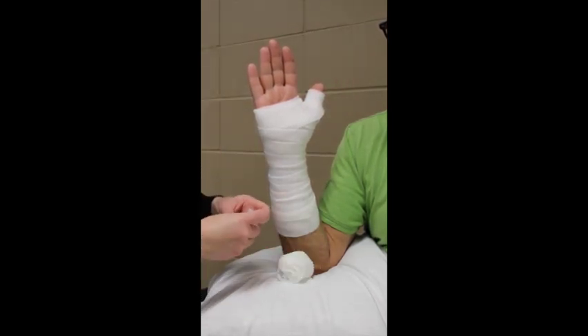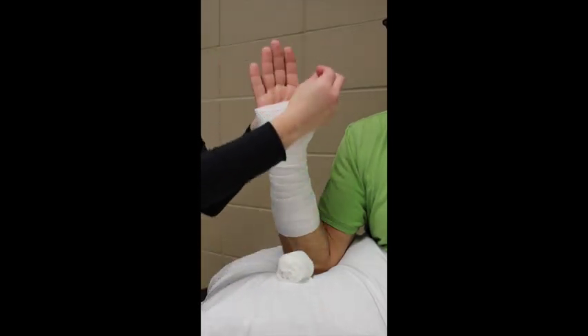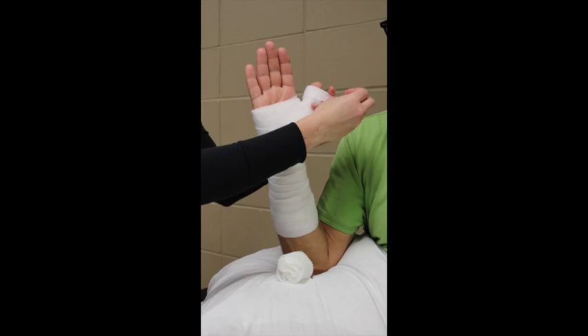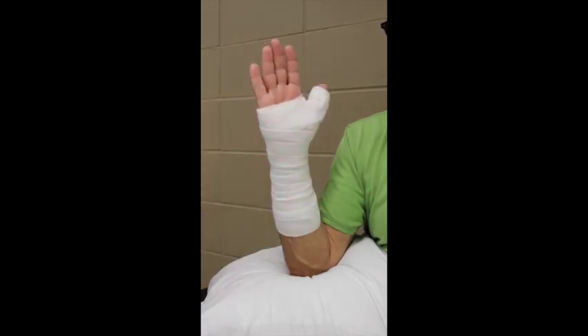To add a couple more layers to the thumb, make a cuff by tearing a small piece, folding it lengthwise, and wrapping it around the distal aspect of the cast padding so the splint does not rub.